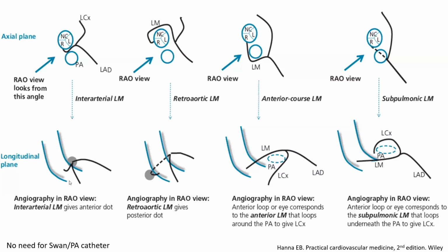So this is how you can define the boundaries of that aorta. You can also do a non-selective shot so that you focus on seeing that aorta and aortic boundaries, okay? So we see where that aorta is in an RAO view, and accordingly, we can tell what the course is. This is how each course projects.